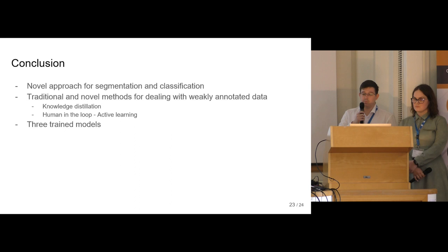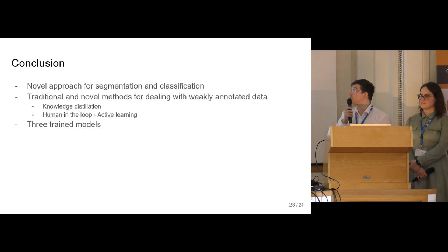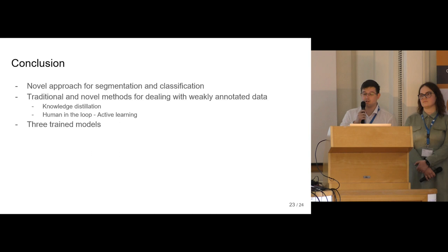To summarize, our main contributions are a robust model for nuclei segmentation in different organs and resolutions, a teacher model usable for training other students, and a relatively small network that is well adapted to a specific task, which is cell classification in H&E images.